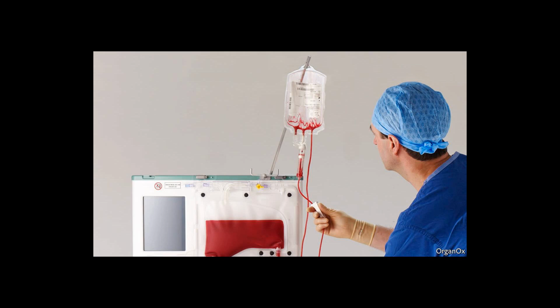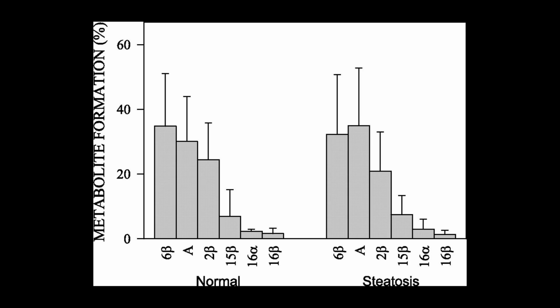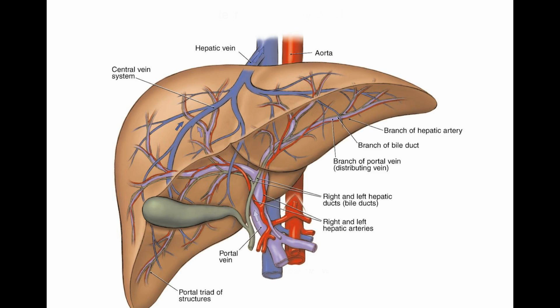A series of studies in 2004 showed that a BAL device reduced mortality by about half in acute liver failure cases. The studies, which covered 171 patients in the US and Europe, compared standard supportive care to the use of a bioreactor device using pig liver cells.